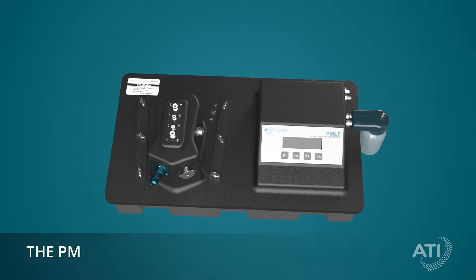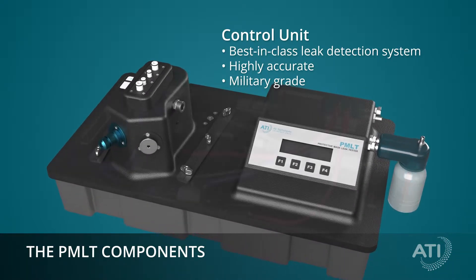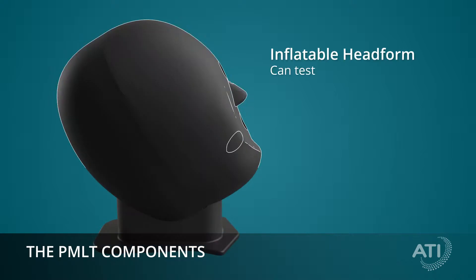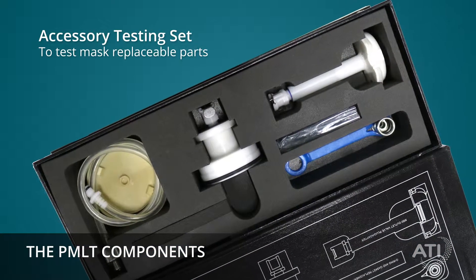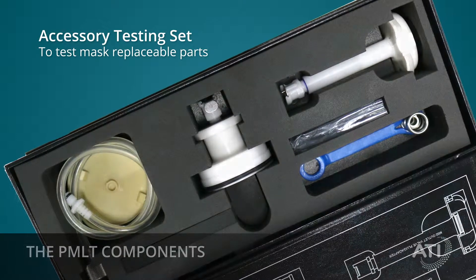Here's how it works. The PMLT control unit is a highly accurate leak detection system with aerosol generation and photometric instruments. The inflatable head form enables masks of all sizes to be tested, and a complete set of accessories enables replaceable components to also be tested on most market-available masks.